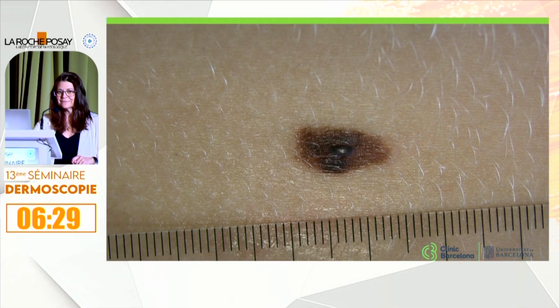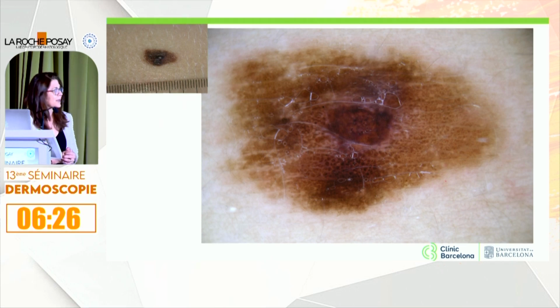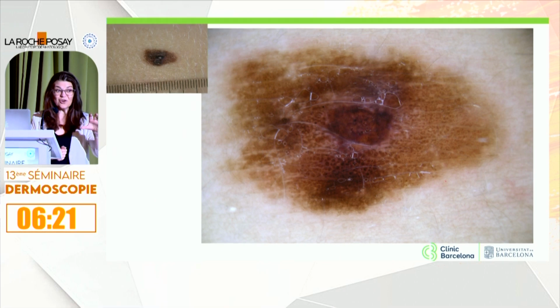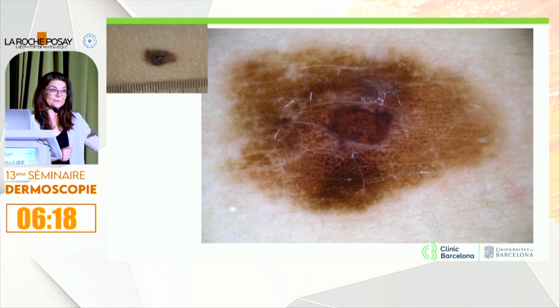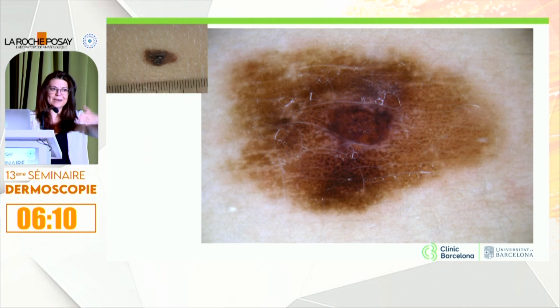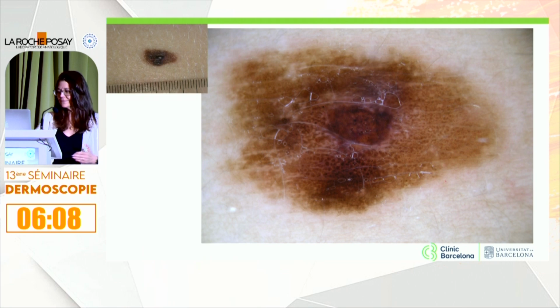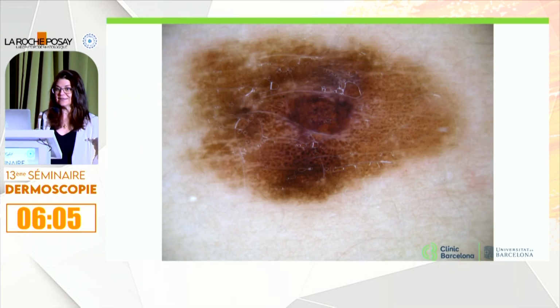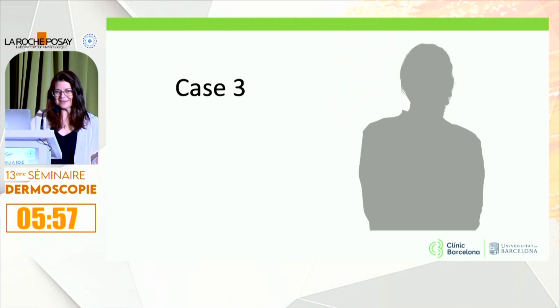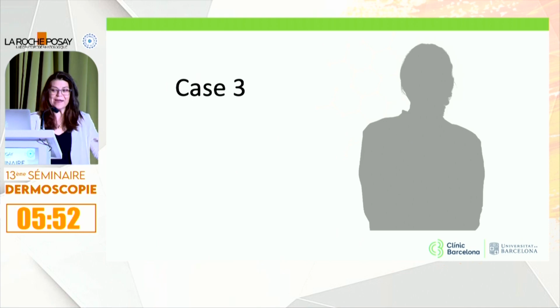Huh, okay, let's do dermoscopy. And under dermoscopy, what do we see? Grayish color, yes. And the negative of the pigment network. Do you remember that yesterday I told you, be careful with the negative of the pigment network? It could be a sign of melanoma arising in a nevus. Then, I don't like to excise benign nevus in children. But of course, in this case, I excise. And this lesion was a melanoma arising in a nevus. Then, be careful. Usually it's extremely rare, but it exists.